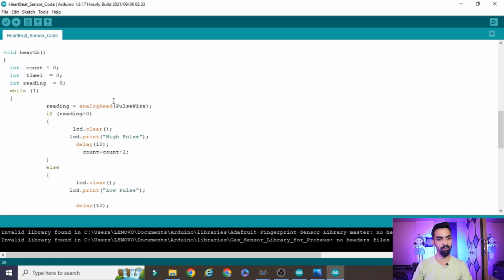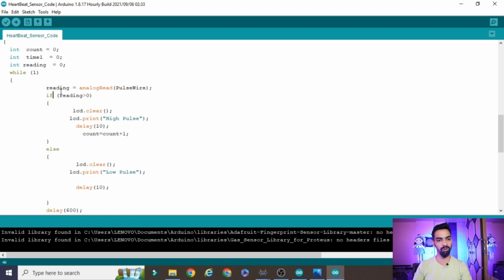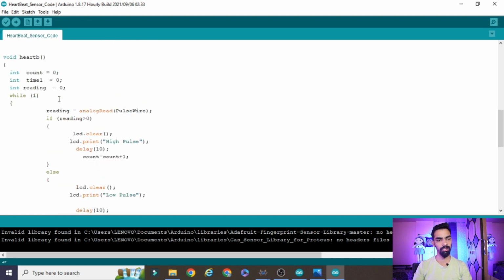Inside this function there are some variables. Count is the variable where we store the final count. Then timer is used to monitor the 10-second time. And reading is a variable which reads the 1 or 0 signal from the heartbeat, the high or low pulses. The while 1 is the continuous part of this logic, because the logic has to run continuously until the 10 seconds are completed. That's why it is a while loop here.